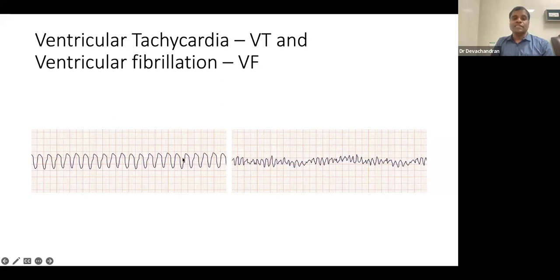So this is something that we already talked about on the left. There is electrical activity. The ventricular rate is about 300. The QRS is regular because between two R waves, there is only one large square. The QRS is quite broad. You can see it's going up to one large square. I can't see any P waves. Here it is tachycardia because the rate is about 300. It is a broad complex tachycardia.